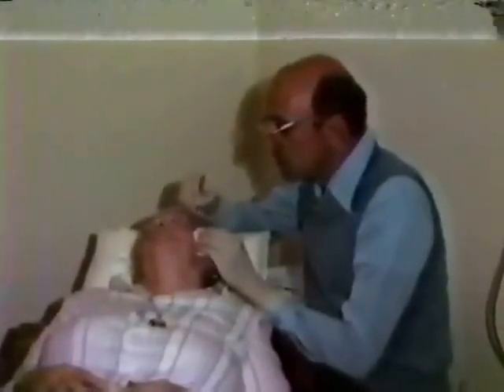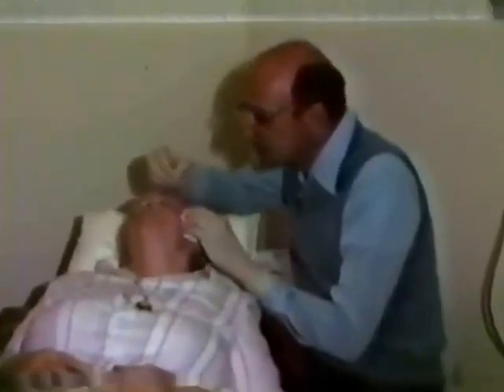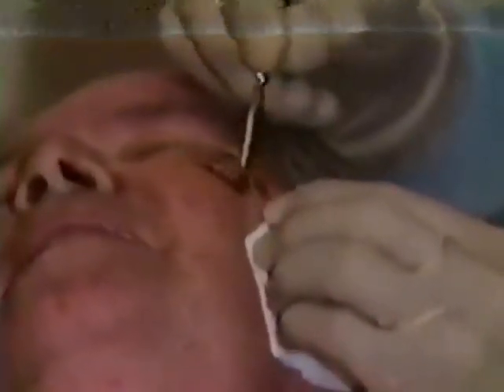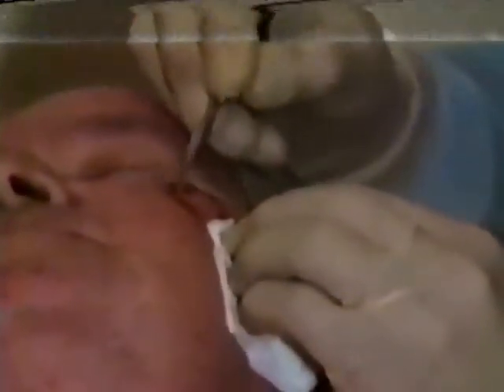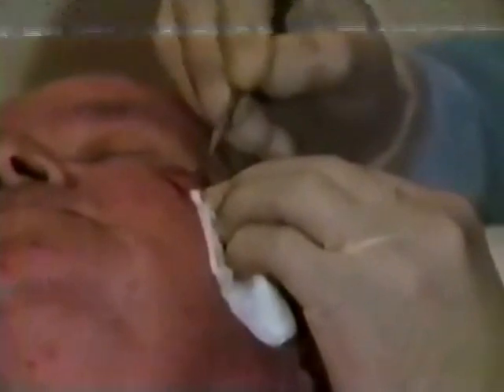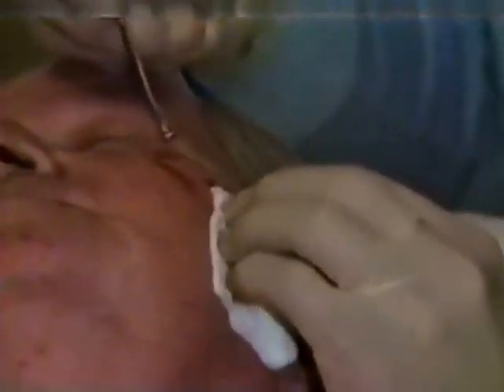We're merely scraping the little islands of tumor so we can better delineate the skin cancer. Now, Dr. Kierney, isn't using that instrument, the curette, does it burn a little bit? That particular instrument is actually a technique used to remove skin cancers without the liquid nitrogen freezing as well. And the advantage here is to remove as much of the tumor before actually starting the freezing technique, in this way to greatly prevent a recurrence of the tumor.